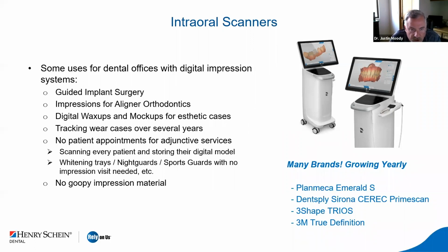We also use these intraoral scanners for guided implant surgery and creating our surgical guides. In our offices that are far away from orthodontists, we use this for aligner technology, digital wax-ups and mock-ups.